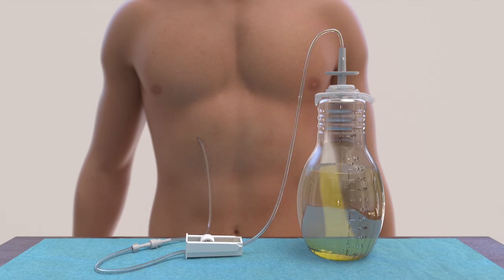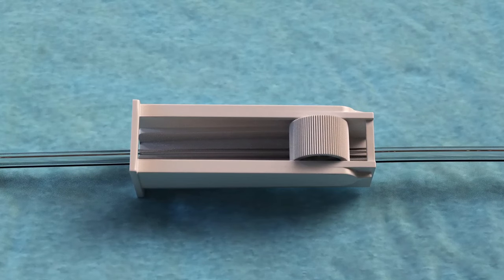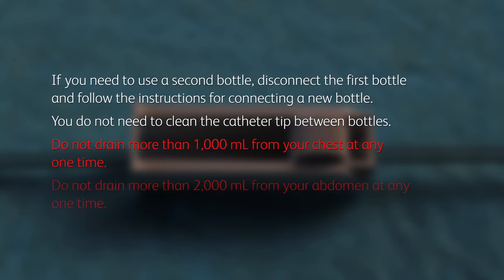When you're finished draining, or if the bottle is full, close the clamp on the drainage line completely by rolling the wheel toward the bottle. If you need to use a second bottle, disconnect the drainage line and follow the instructions for connecting a new bottle. You do not need to clean the catheter tip between bottles. Do not drain more than 1,000 milliliters from your chest at any one time. Do not drain more than 2,000 milliliters from your abdomen at any one time.